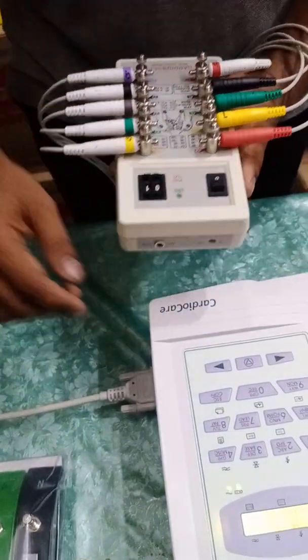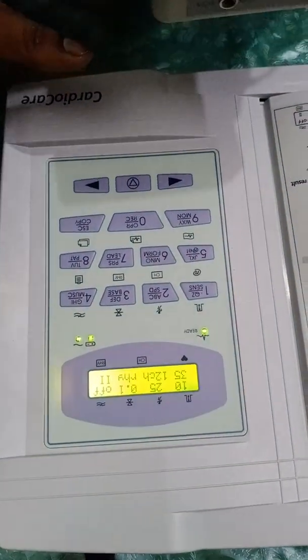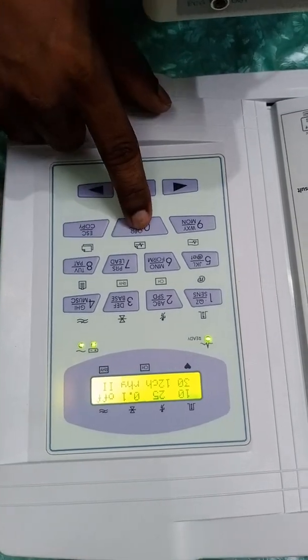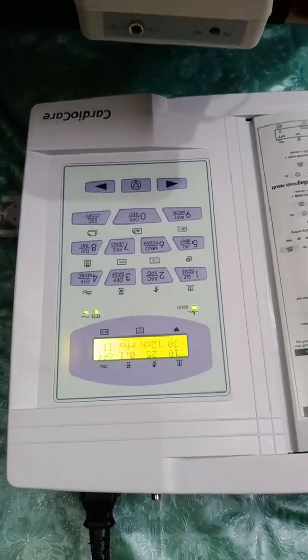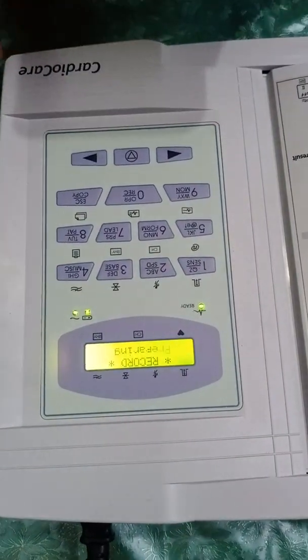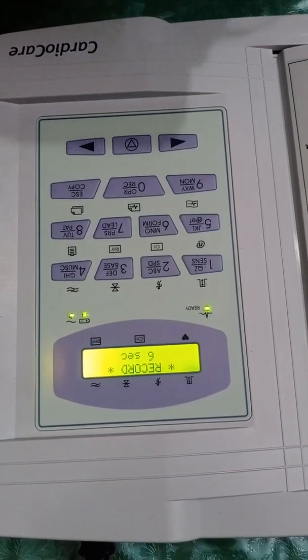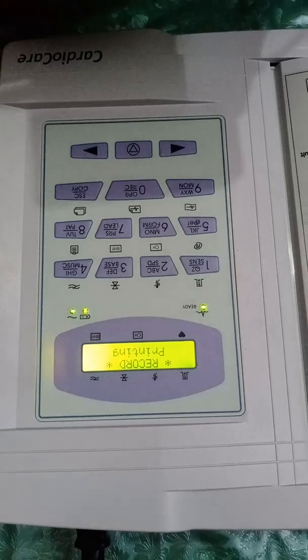The machine is now working. When everything is ready, I press the recorded printing option. This button records 10 seconds of ECG data. Once the waves stabilize it will produce a perfect result. You can see it counting: one second, two seconds, three... six, seven, eight, nine, ten seconds — and now it is printing.